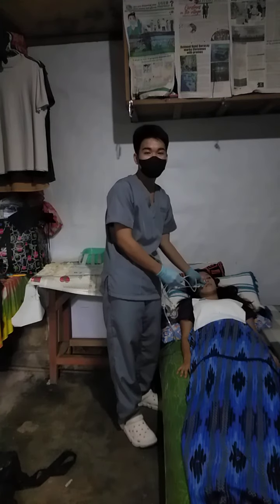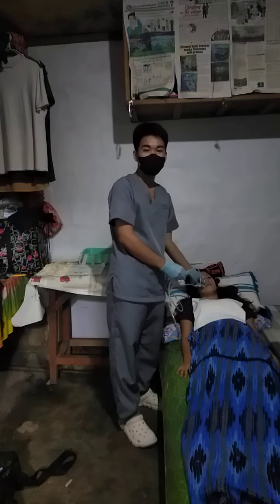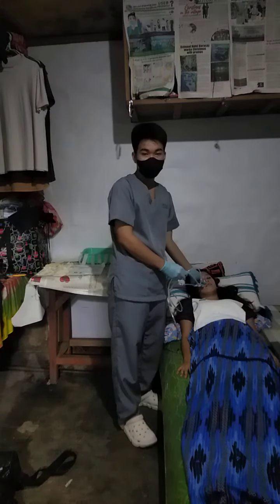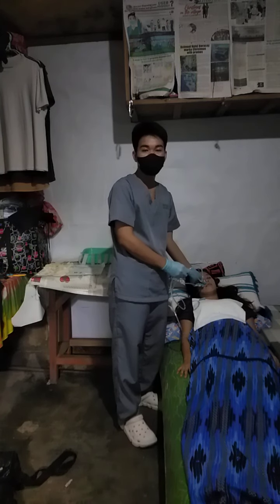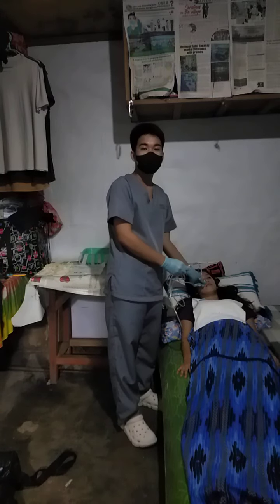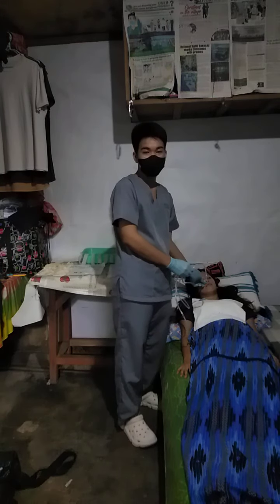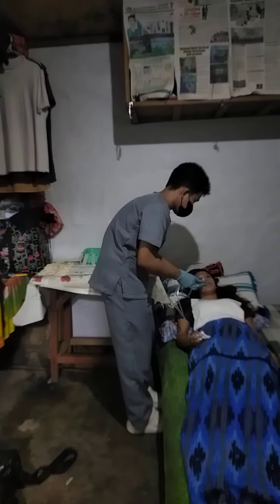ask the patient to slightly flex the head back against the pillow. Gently insert the tube into the nostril while directing the tube upward and backward along the floor of the nose. The patient may gag when the tube reaches the pharynx. Provide tissues for tearing or watering of eyes, and then offer comfort and reassurance to the patient. So, ma'am, tissue po. Flex lang po natin yung head natin.